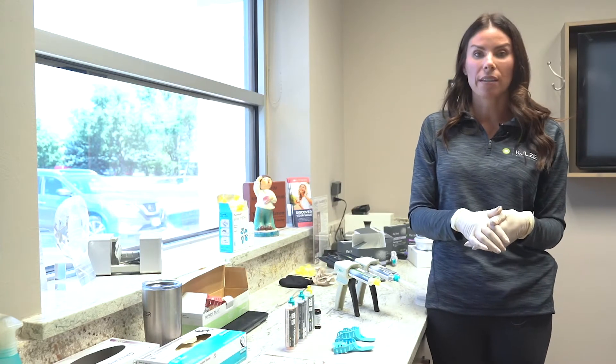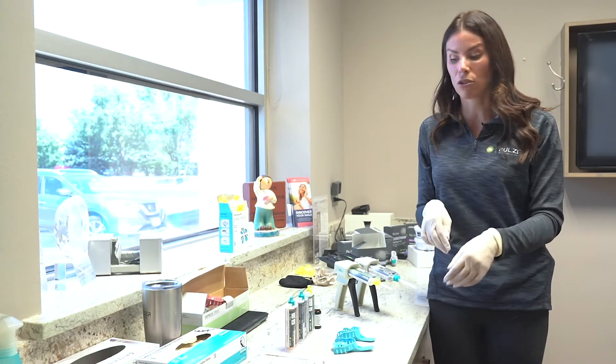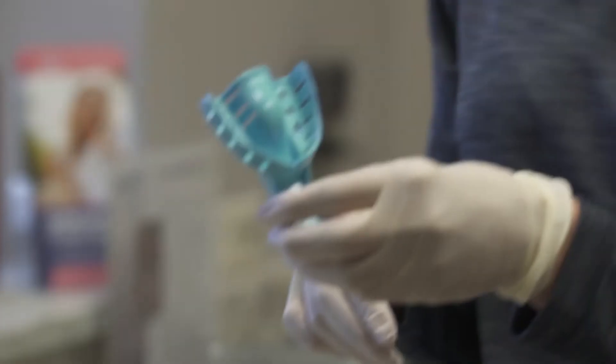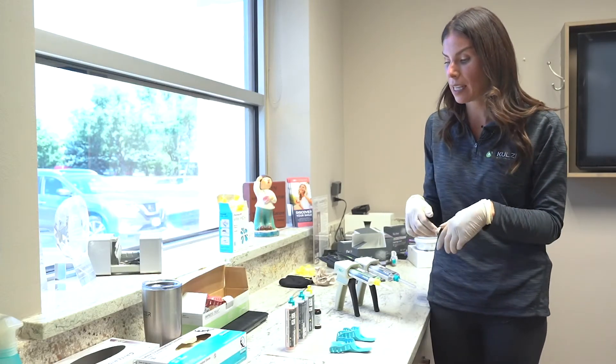First, I want to talk about tray selection. Tray selection is crucial in taking a great impression. You want to make sure that your tray accurately fits the patient's mouth.